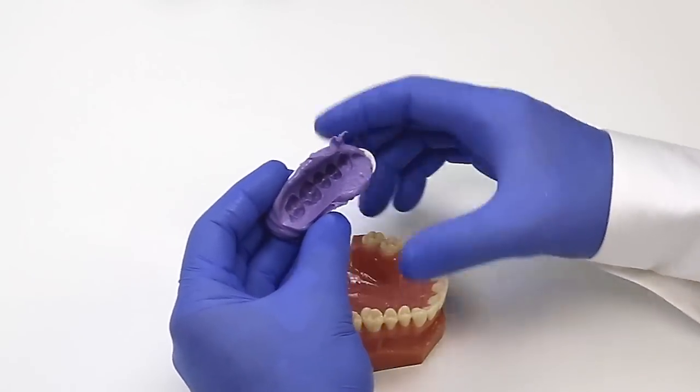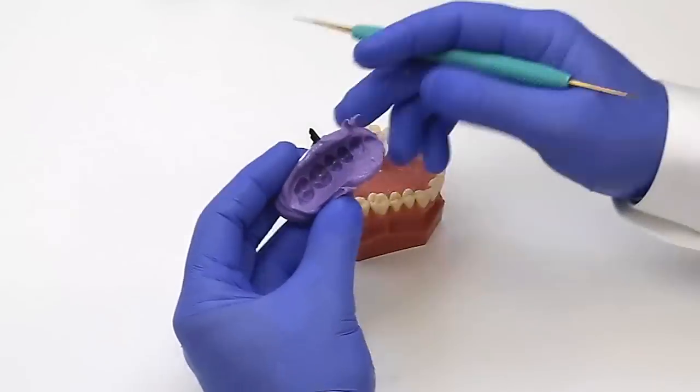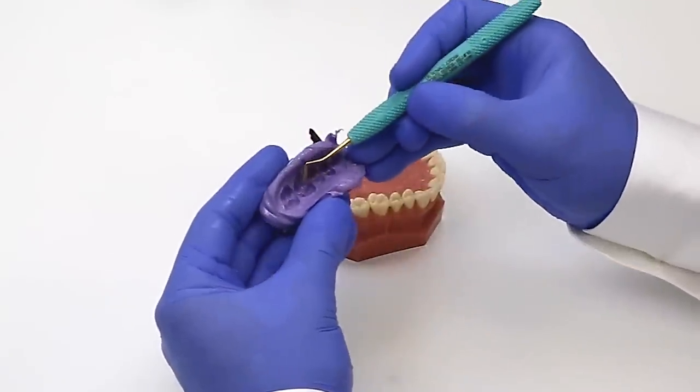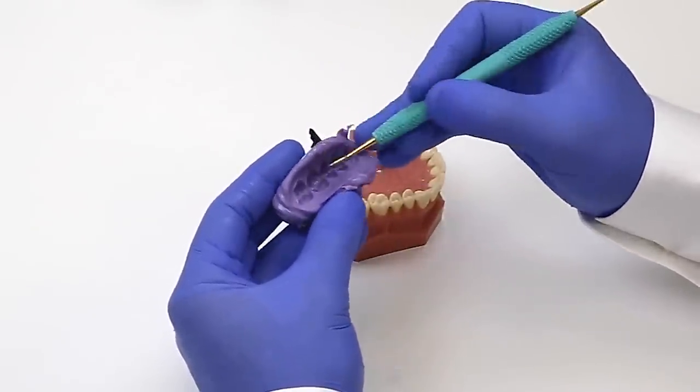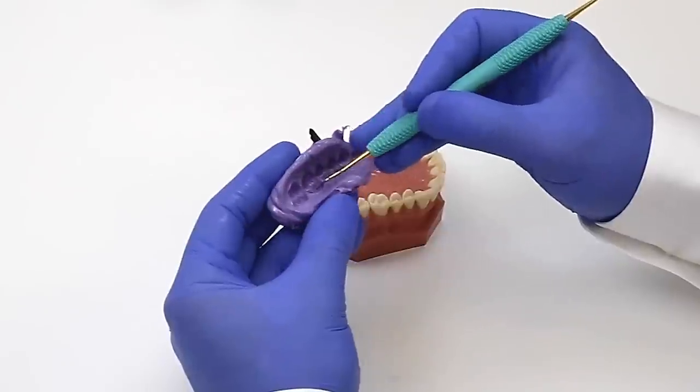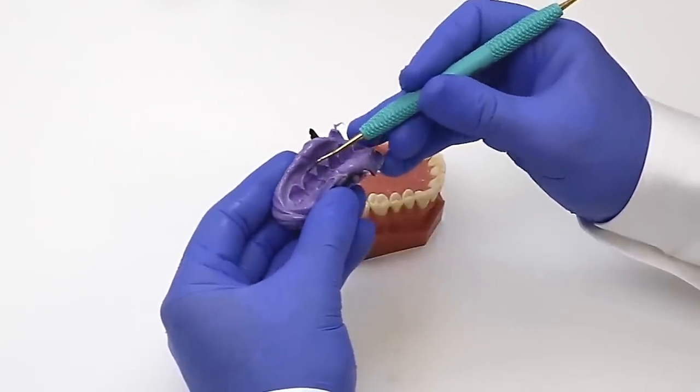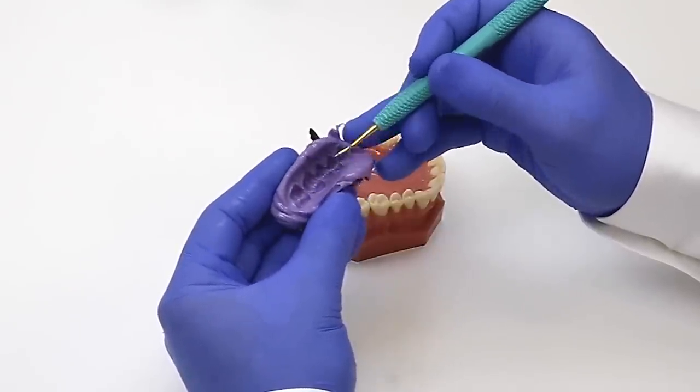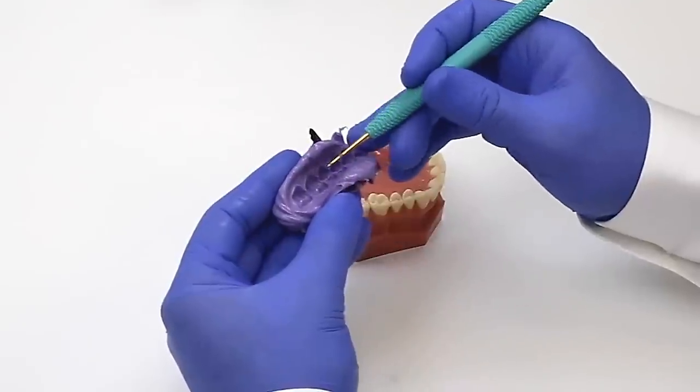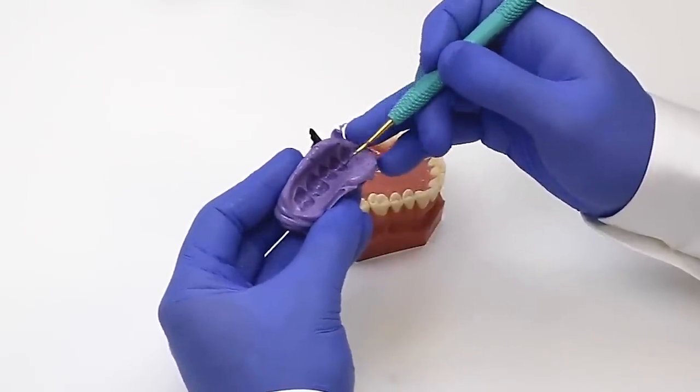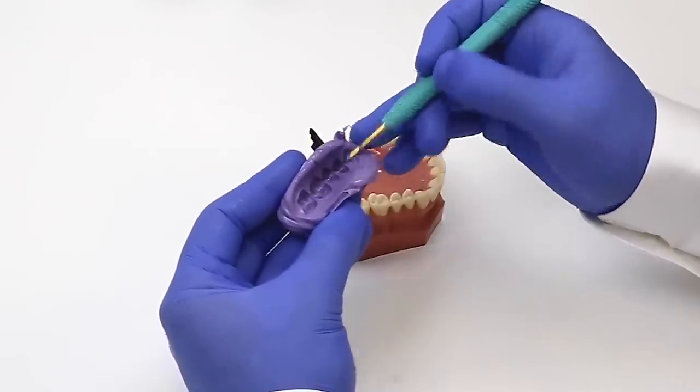And if you look at the detail, we've captured all the occlusal pits and fissures. We have all of the gingival margin around not only our tooth that we're about to prepare, but also every other tooth in the arch. So that's ready to go.